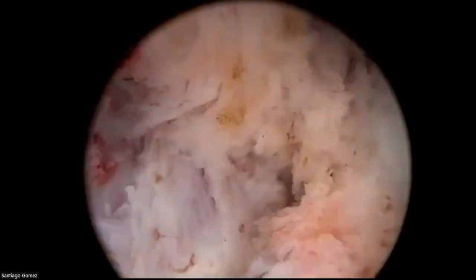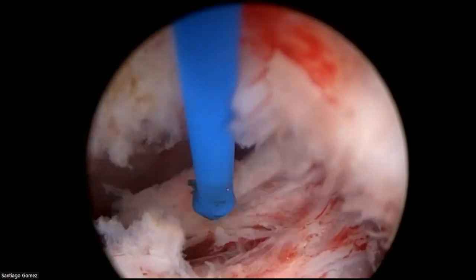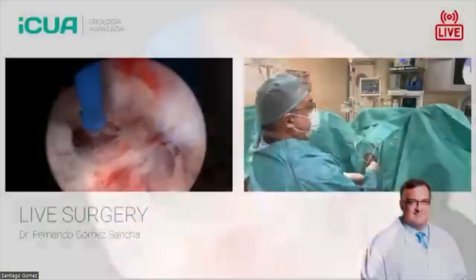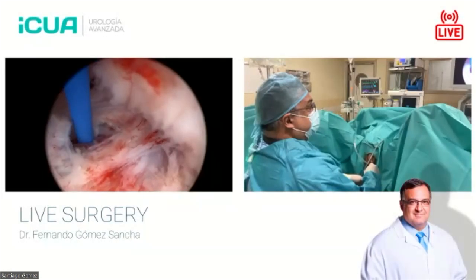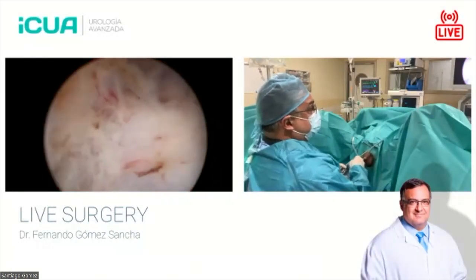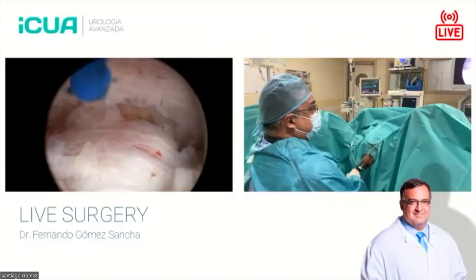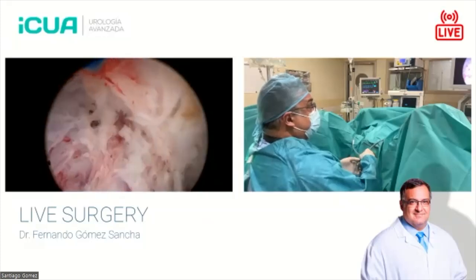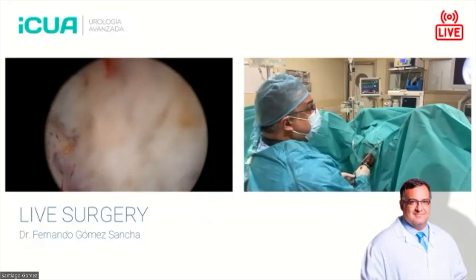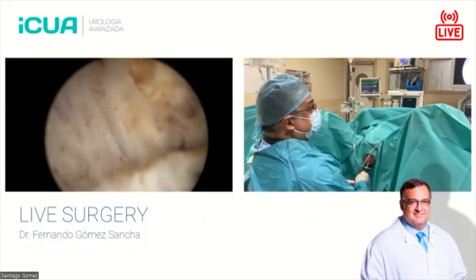Okay, so now what I'm going to try to show you, and we can continue on that. You see, this side, we did this dissection, the apex fell a little bit. Detaching it from the anterior allows the apex to fall down. And here on this side, we have the same picture. You see, we have this plane. And now in between, we have the 12 o'clock fibers. So now it becomes very easy to cut these fibers because we have perfect orientation.